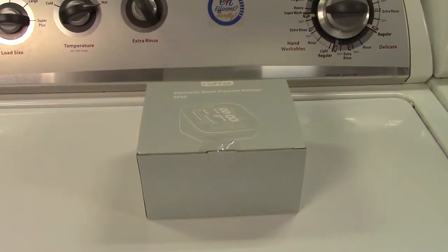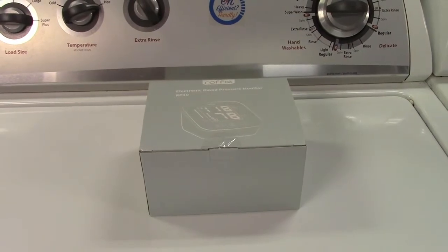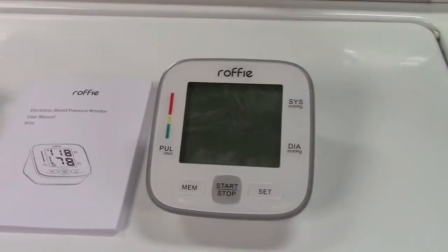This is the Rafi upper arm blood pressure monitor. Let's take it out of the box. In the box you get the arm cuff, a user manual, and of course the unit itself.